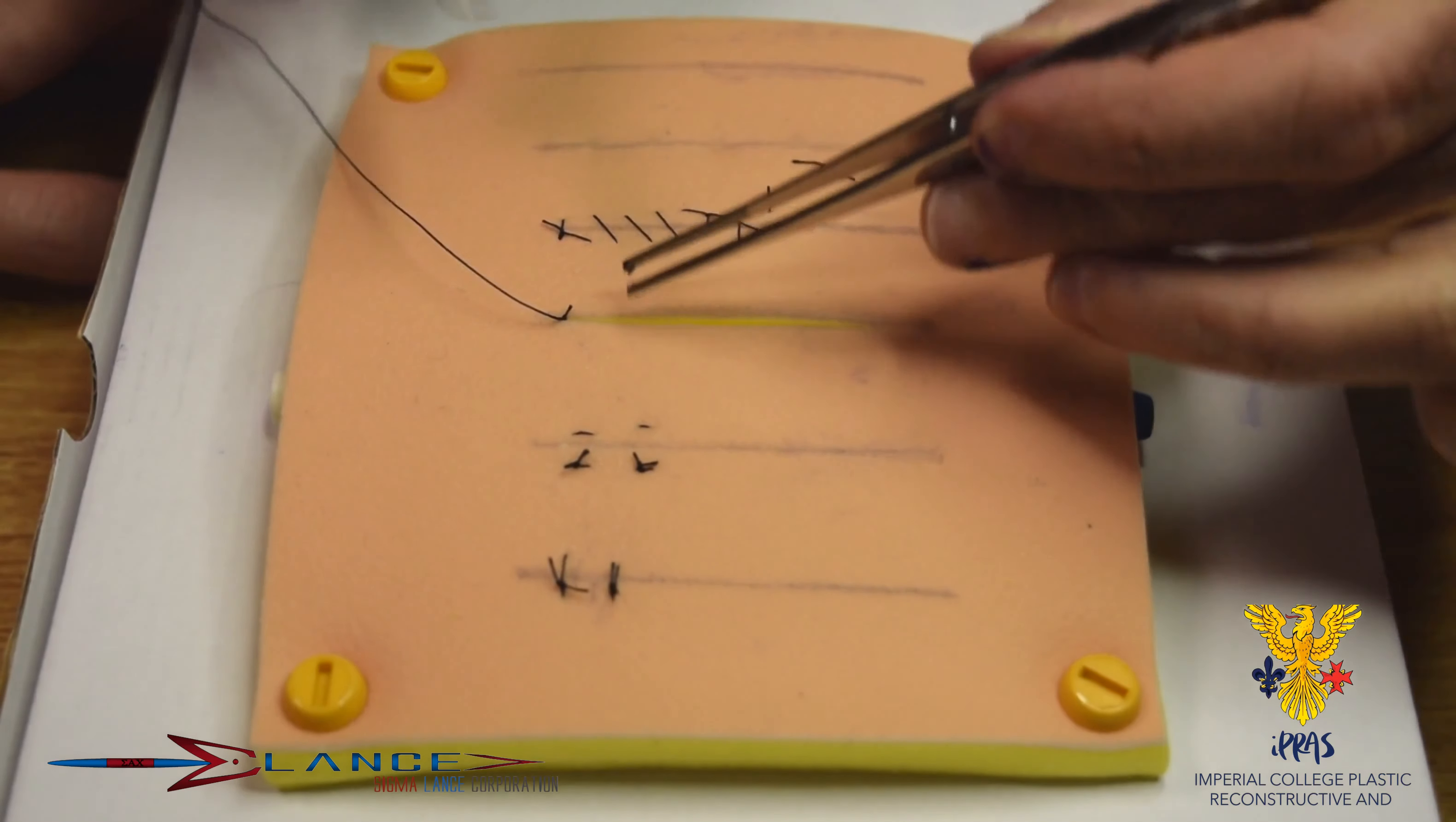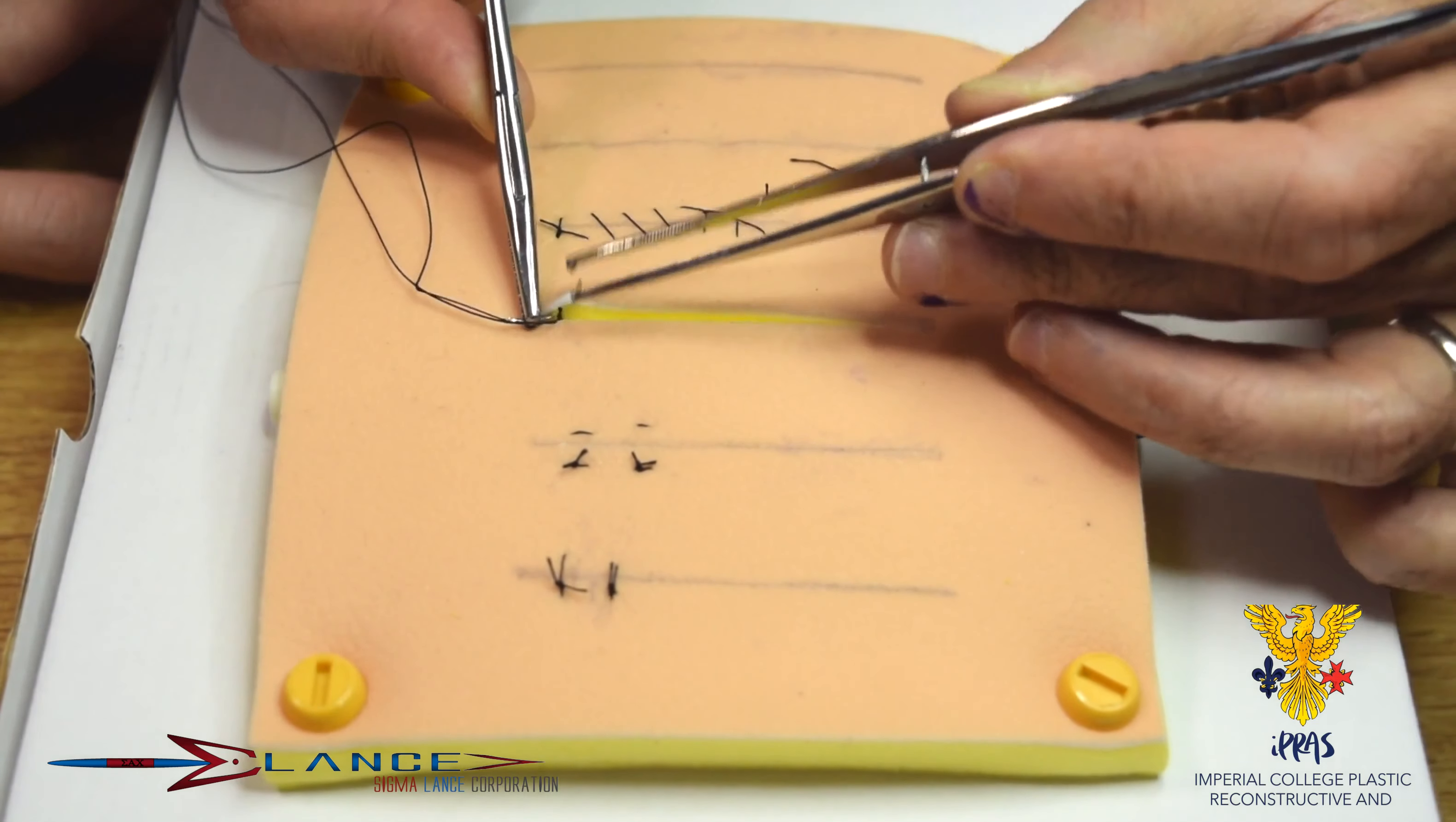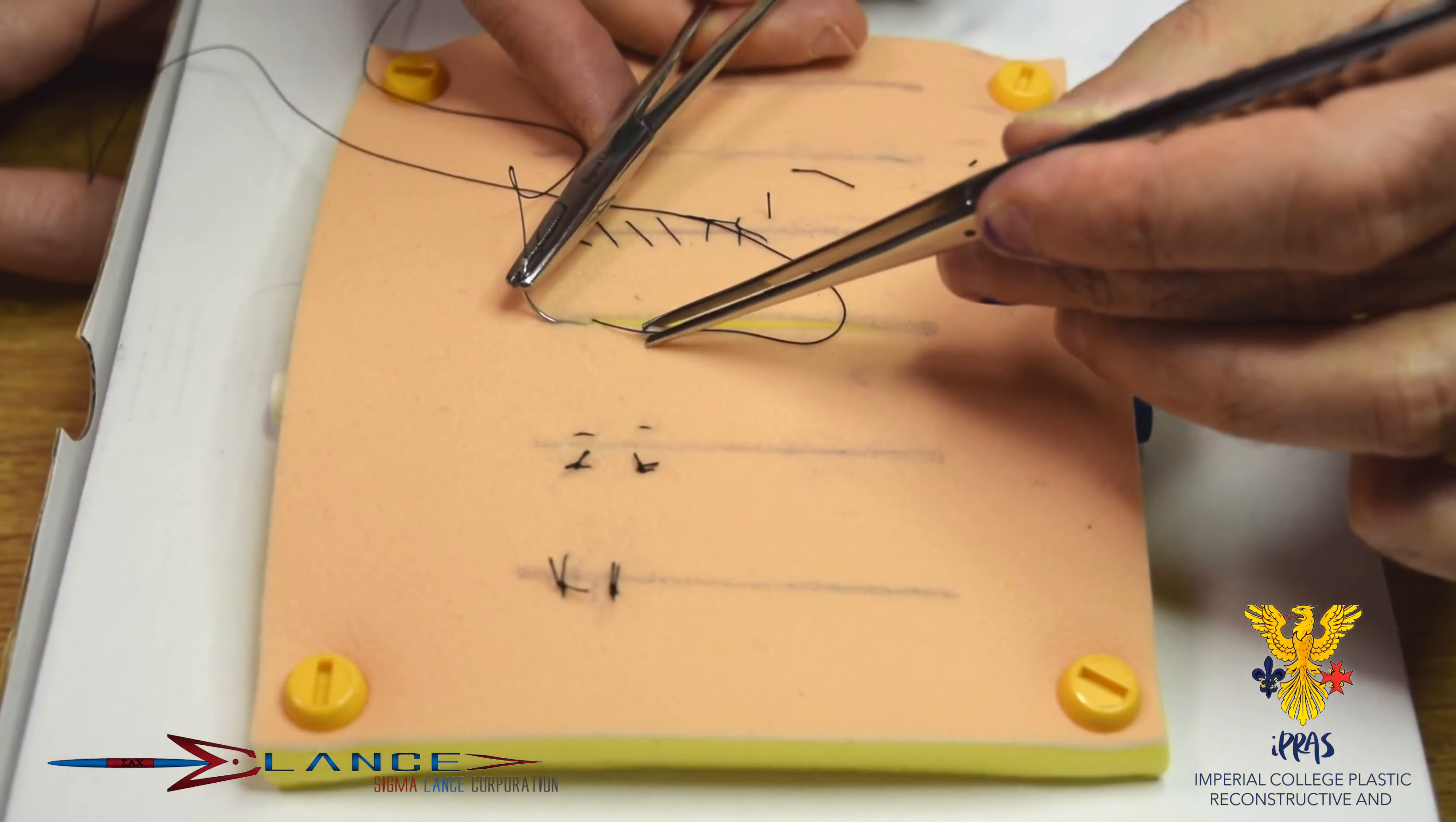And then really, as we talked about before, the closure has to go in a horizontal fashion, try to stay in this white dermal layer, and the next stitch must be slightly behind where the last stitch comes out on the opposite side.